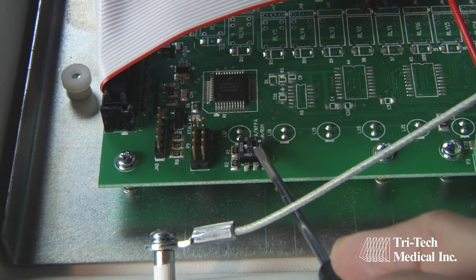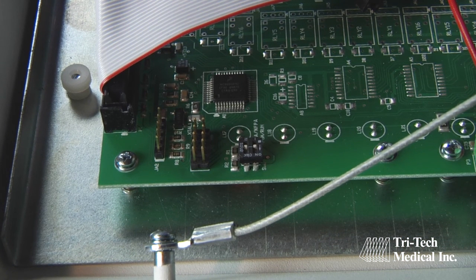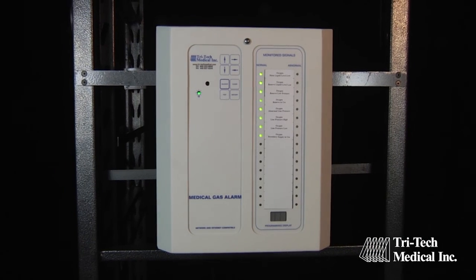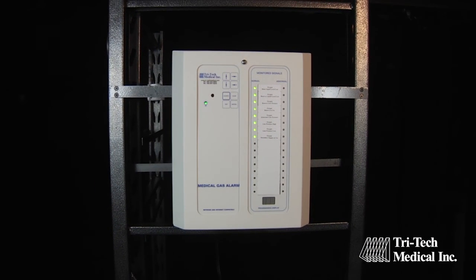When all of the signal points on the circuit board have been programmed, return the DIP switch to the run position and then proceed to the next circuit board in the alarm panel, continuing in the same manner until all of the circuit boards have been programmed.